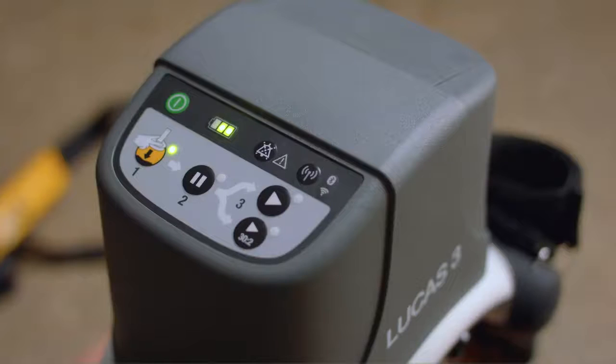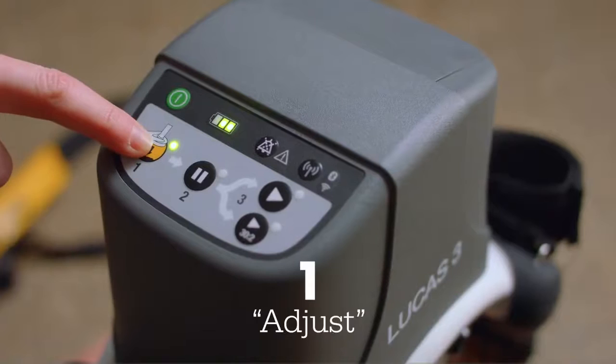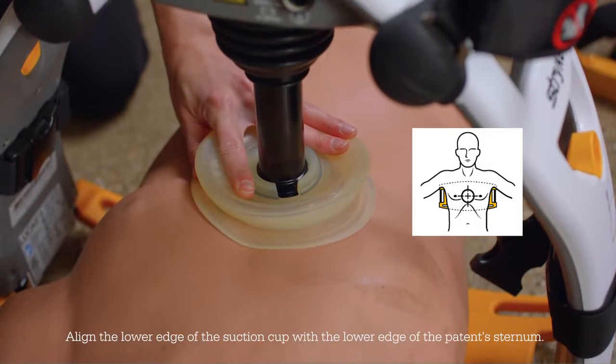The controls on the Lucas device are labeled 1, 2, 3. First is adjust mode and indicates lowering the suction cup to the chest. When placing the suction cup, the compression point should be at the same spot as for manual CPR.